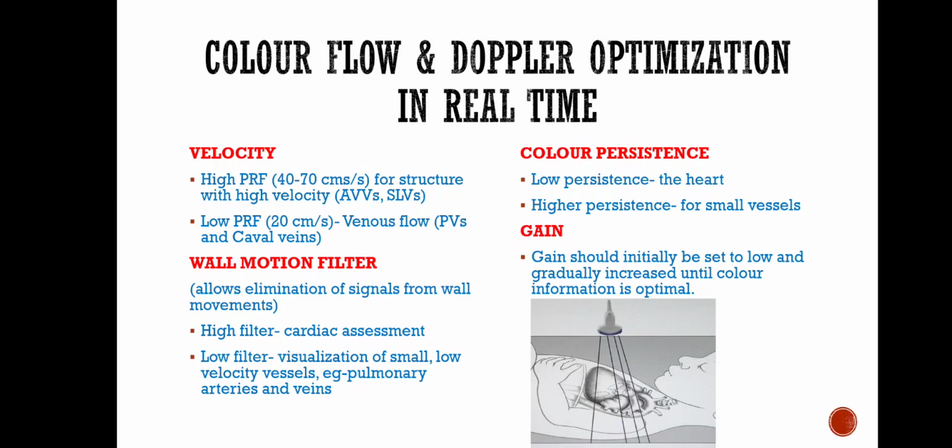Color Doppler optimization. Color Doppler should never be used indiscriminately. Appropriate PRF settings, wall filters, persistence and gain are crucial. Too little gain may hide important flow information, while excessive gain can create artifacts. The objective is to display true physiological blood flow and not machine generated noise.